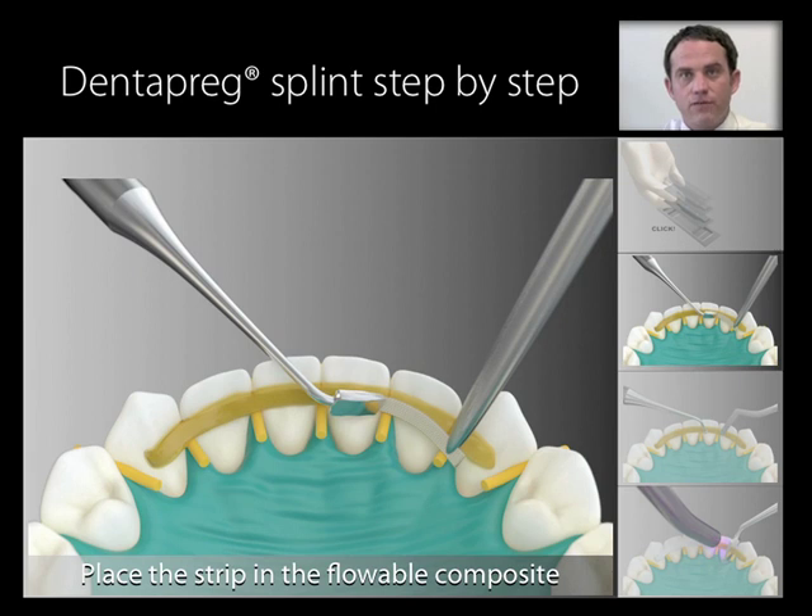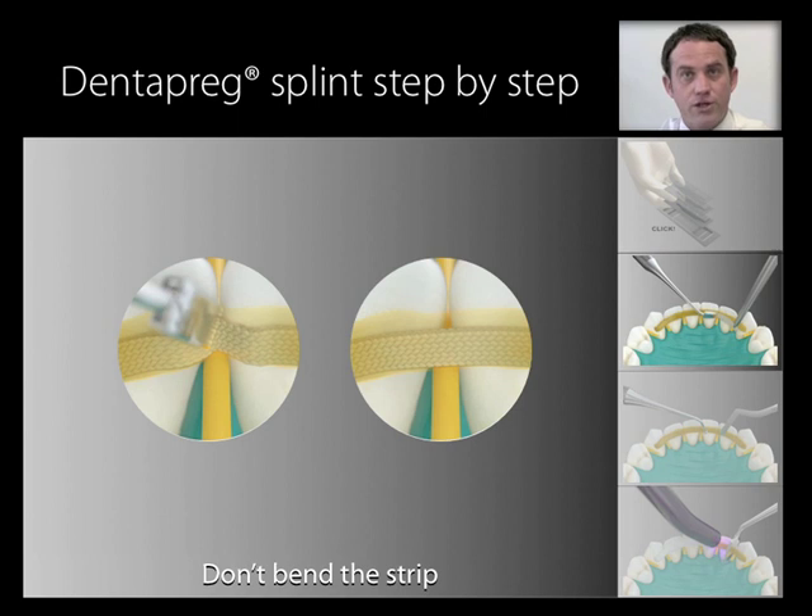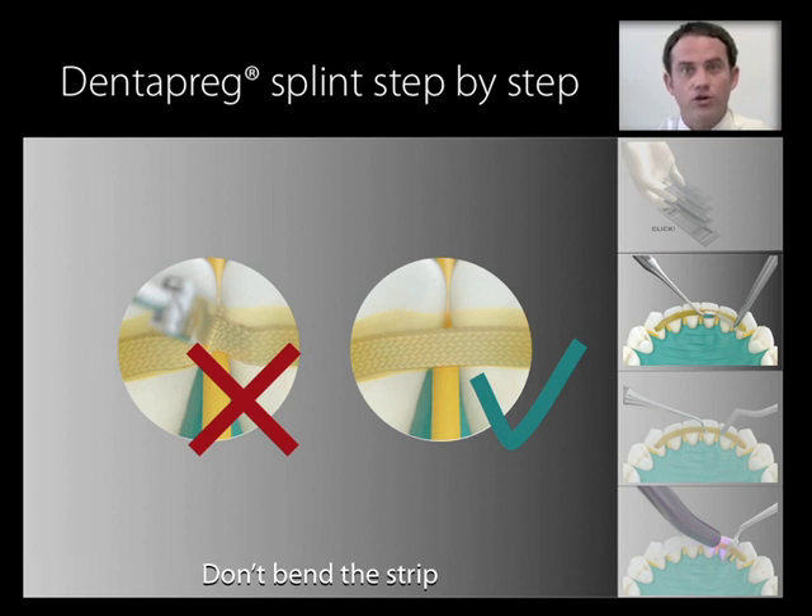Place the strip in the layer of flowable composite. Sink the strip into the flowable composite on one end, slightly keep it in place with an appropriate instrument such as a Dentopreg fork, and continue placing the rest of the strip going tooth by tooth from one end to the other. It is important to not bend the strip into the interproximal spaces. By simply sinking the strip into the layer of flowable composite, you actually increase the overall strength of the splint.